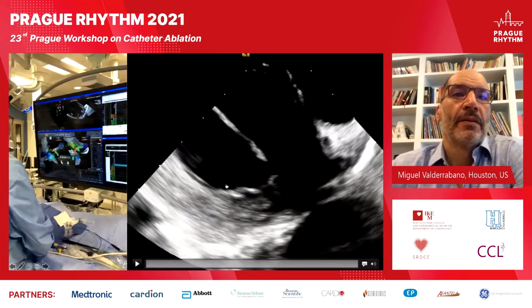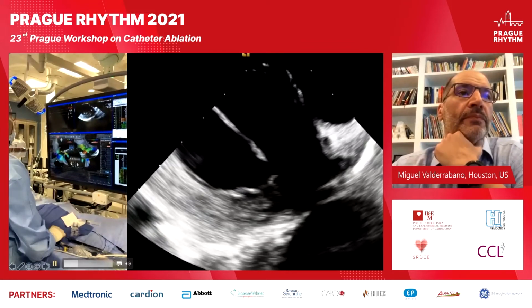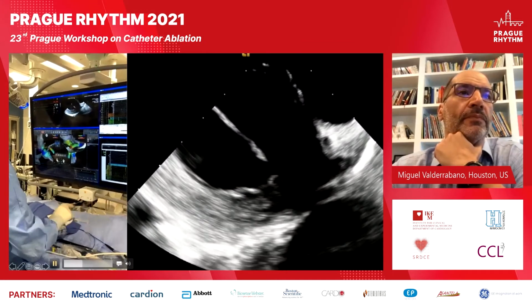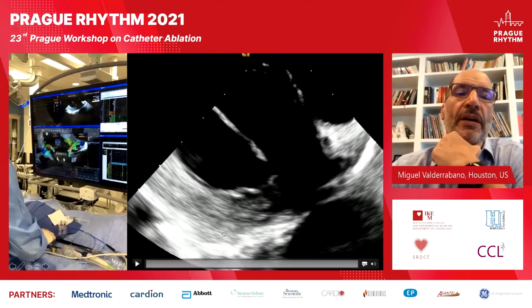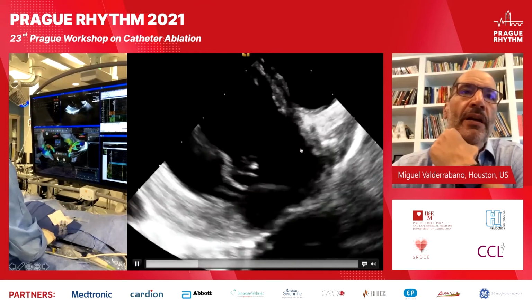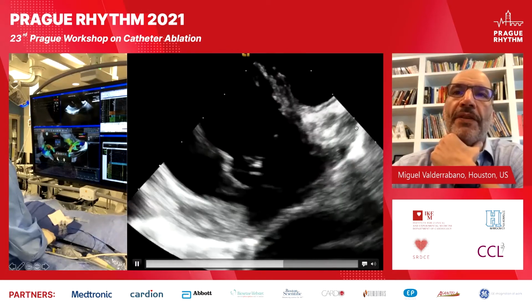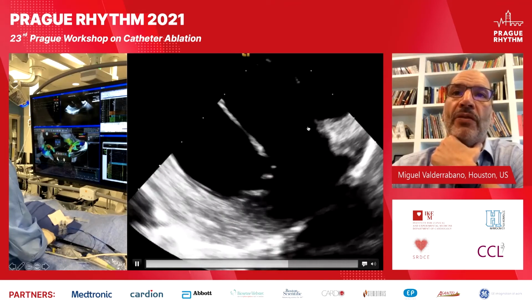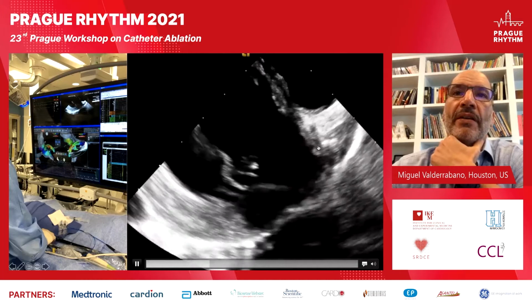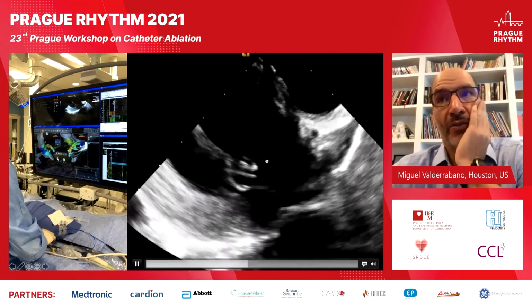You can do it. Okay. Go ahead. So this is taking a reference, Misha, or someone record this on ICE, of the area. We like to see on ICE how echogenic the muscle is in the area of earliest activation as a reference. So you can see here a little bit of RV outflow tract, the muscle of the LV summit, somewhere like here. And this appears like completely indistinct muscle. You will see later after we give alcohol how that looks.